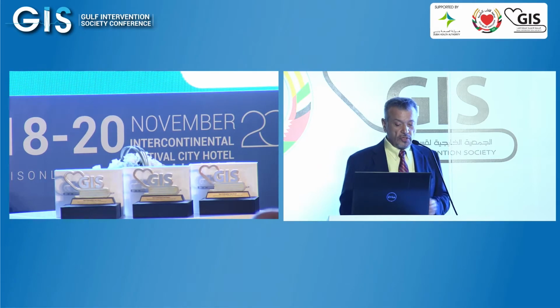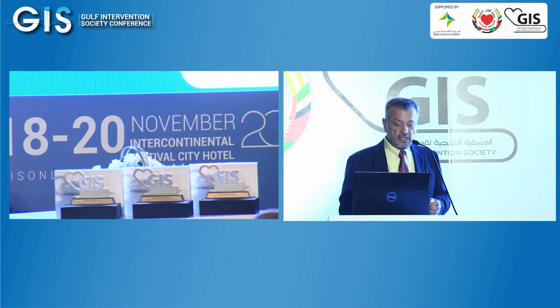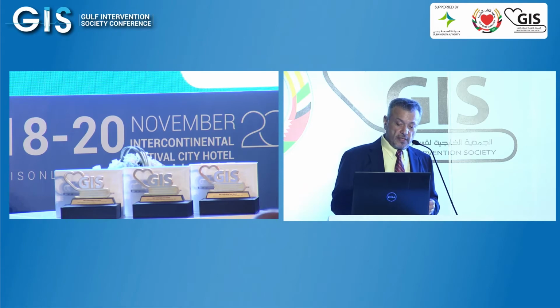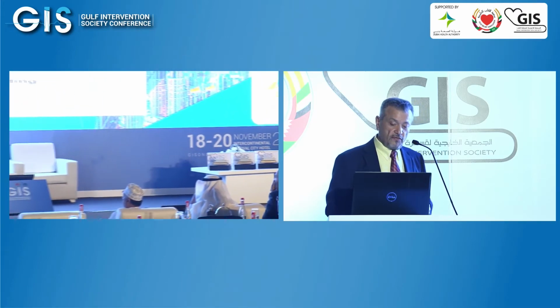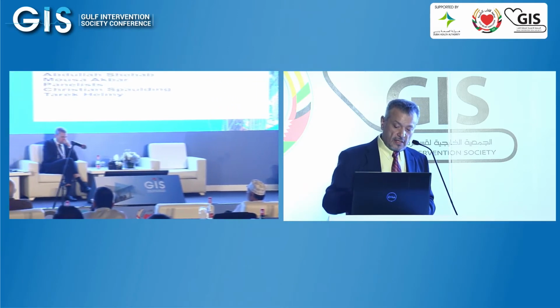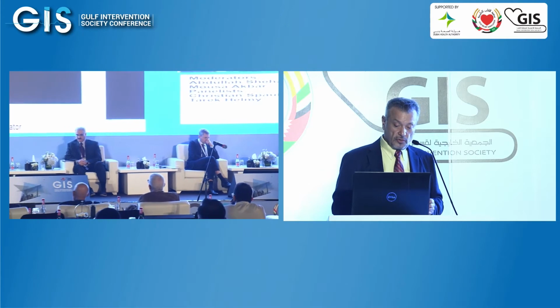This is his right coronary artery. I only have this brief shot. It's basically totally occluded proximally. This is his left coronary system. There is a mid-LCX stent and a mid-LAD stent. But you notice before the proximal LAD stent there is a lesion, and distal to the stent there is another lesion, and there is a diseased segment distal to the left circumflex. And this is the right coronary artery filling retrogradely.